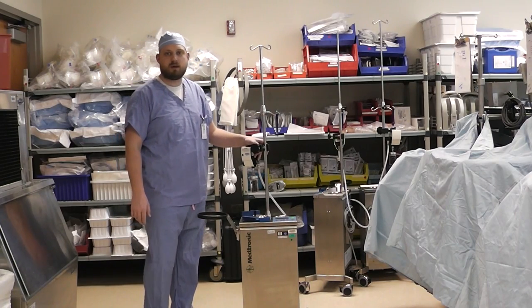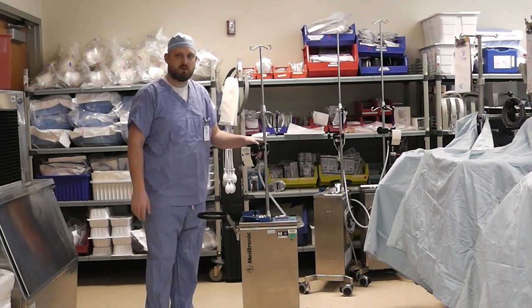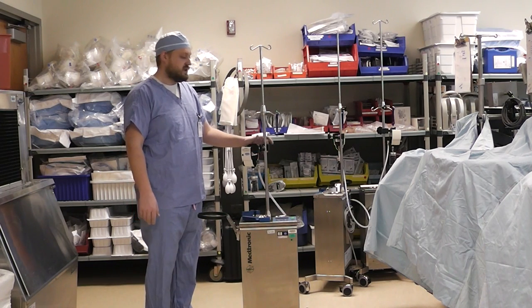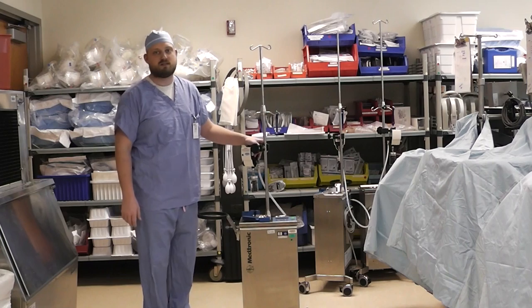Hi, this is Brian Turow from the MSOE Perfusion program with another video in my series for new perfusion students. Today we will be covering how to properly set up and operate the Medtronic Auto Log Cell Saver.